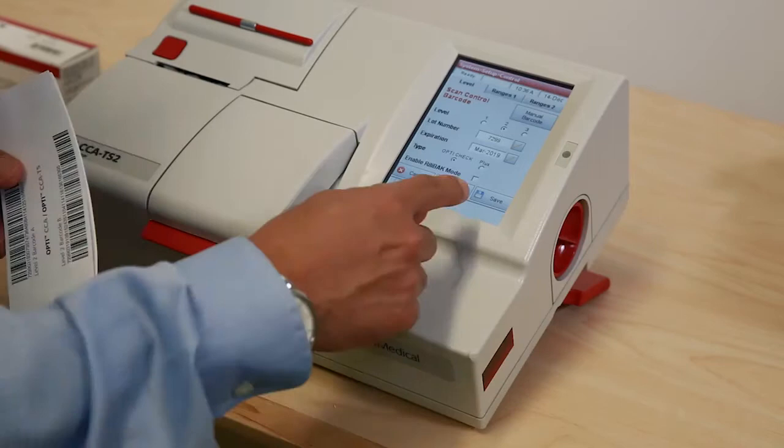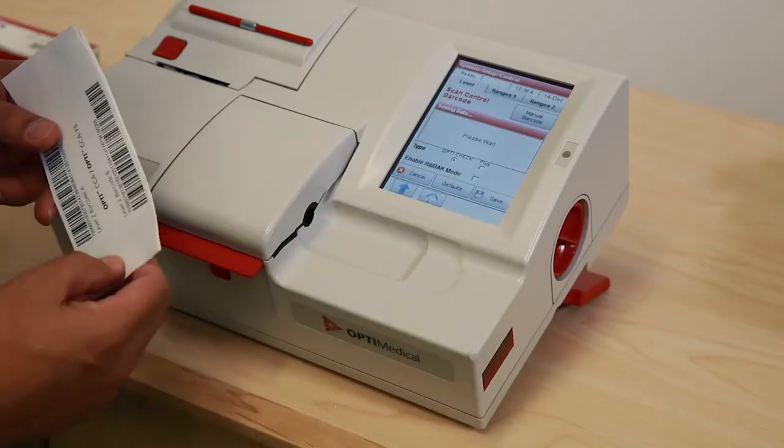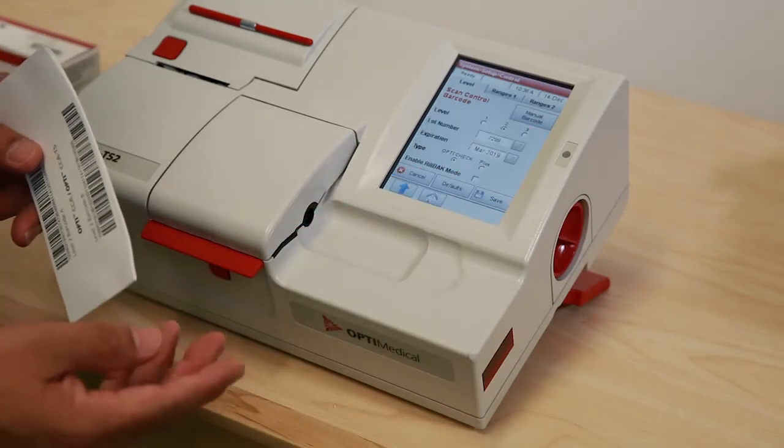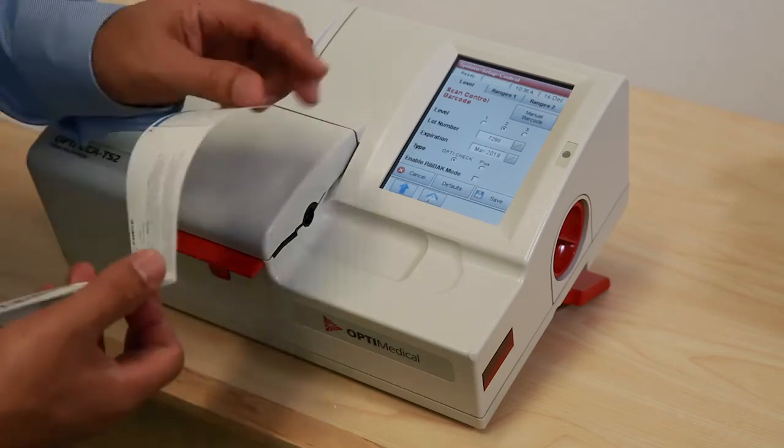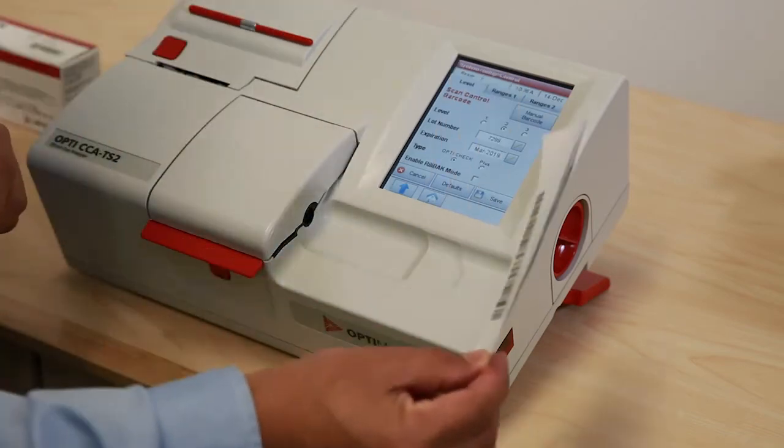Press save. Then the instrument prompts to scan barcode, so the final pending barcode is also scanned into the instrument.